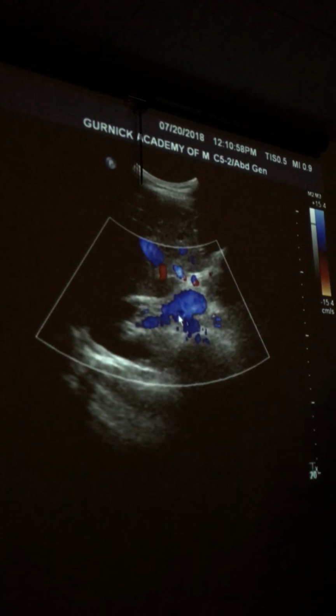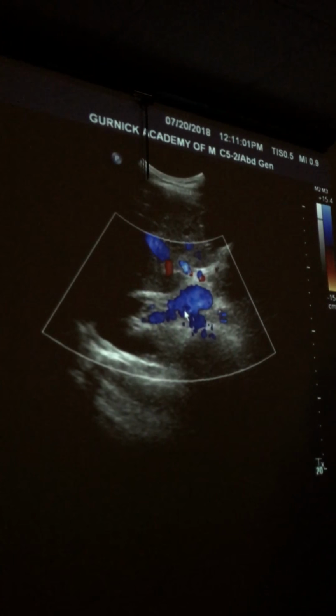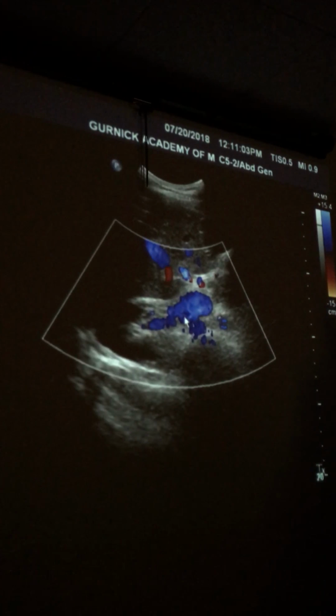Stephanie, is this okay with you as well? Yes, as long as you see the right one coming out of the IVC in there. Like I know you were going to the kidney and you're showing the vein, but you're also off the IVC, going up to the kidney. So IVC, left is this way, right is this way. You know what I mean?